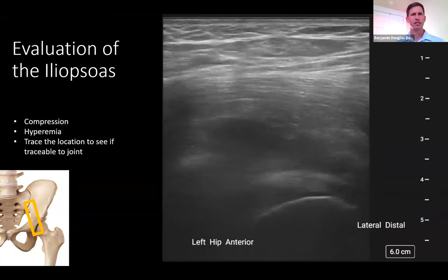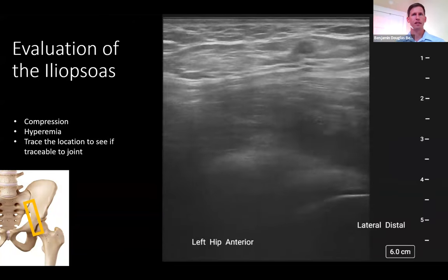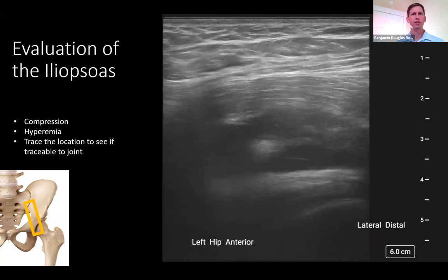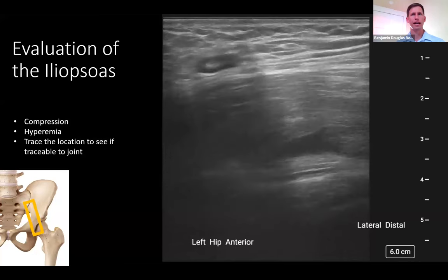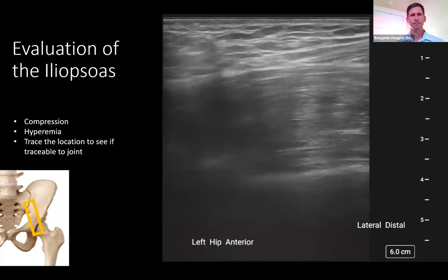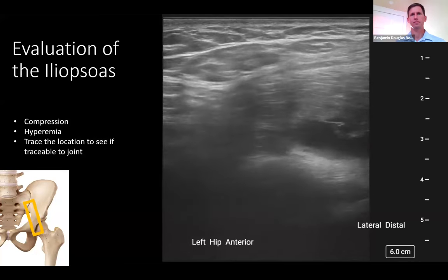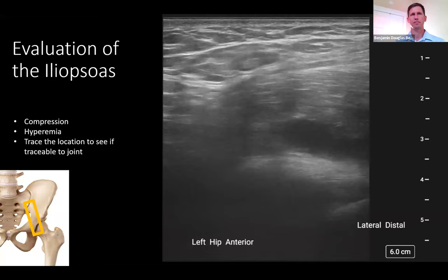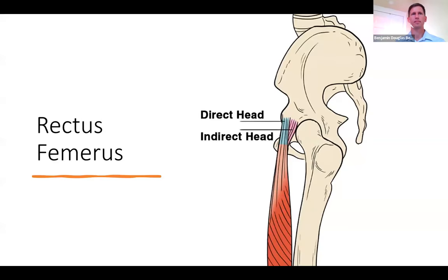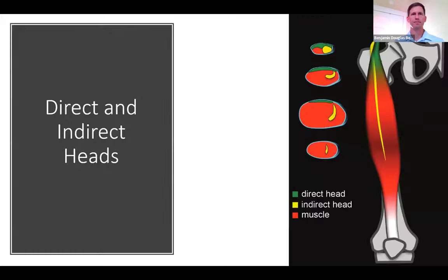This final image is the video of the long axis. After completing the evaluation of the iliopsoas muscle and bursa, we'll move on to the rectus femoris.